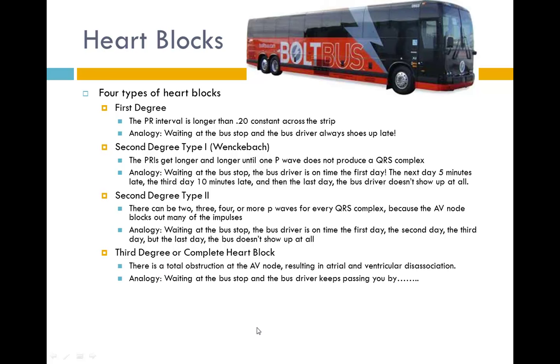Third degree heart block, this is where you have a total obstruction at the AV node resulting in atrial and ventricular dissociation.